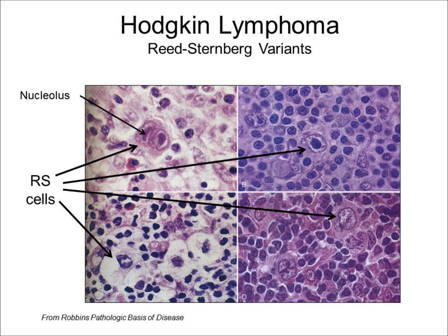Most of the other cells that surround them are normal cells that have been recruited by factors secreted by the RS cells. Now, in this laboratory today, I am requesting that you at least attempt to locate an RS cell.